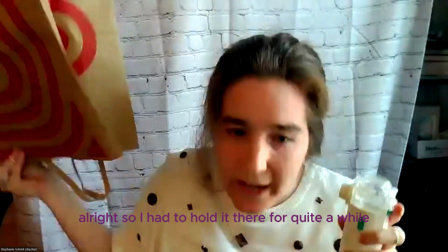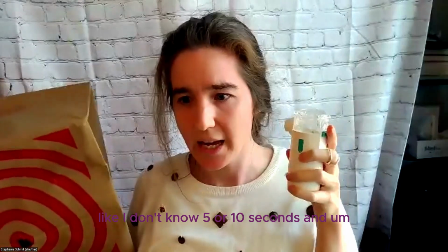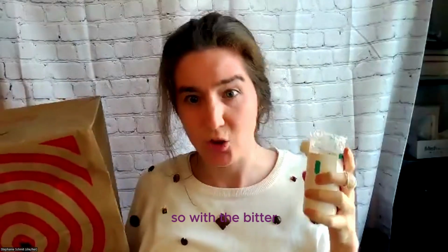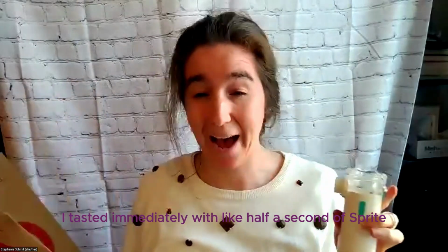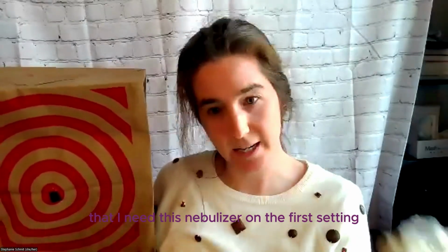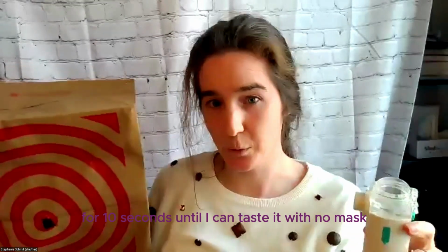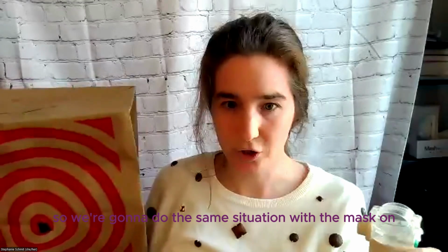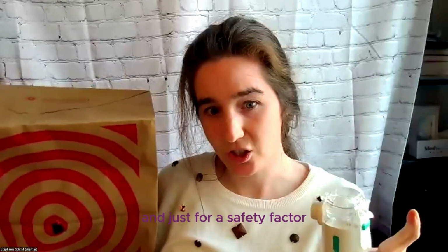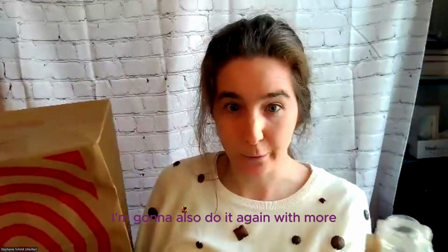All right, so I had to hold it there for quite a while, like, I don't know, 5 or 10 seconds, until I could taste it sufficiently. With the bitter, I tasted it immediately with like half a second of spray. So I've determined with my sensitivity test that I need this nebulizer on the first setting for 10 seconds until I can taste it with no mask. So we're going to do the same situation with the mask on, and just for a safety factor, I'm going to also do it again with more.